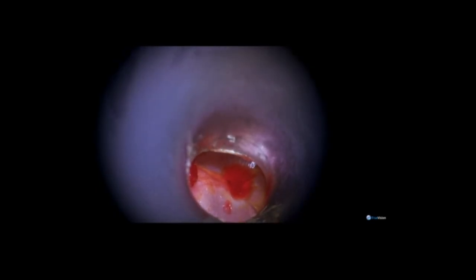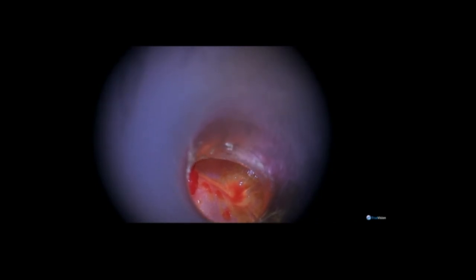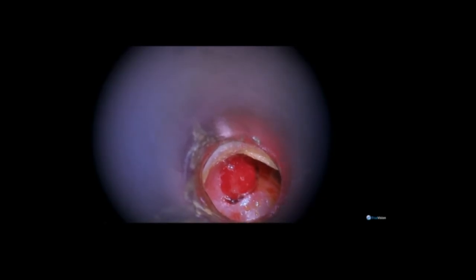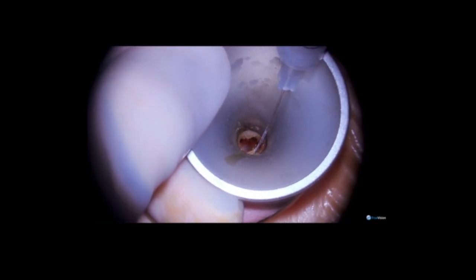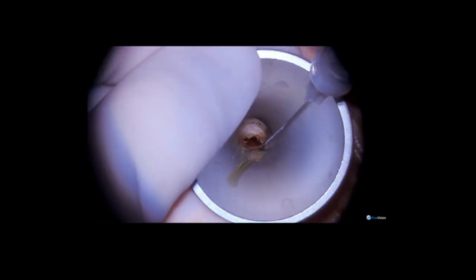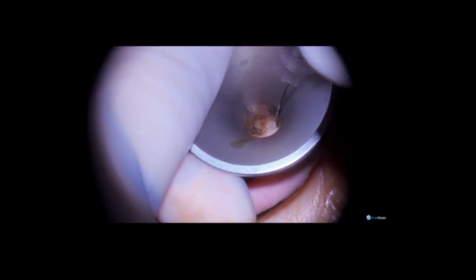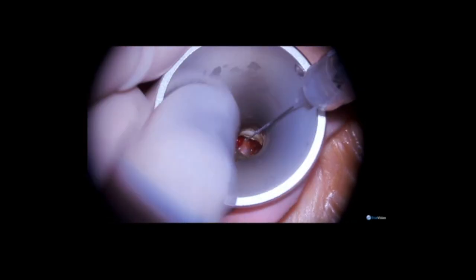Now I'm looking more inferiorly to assess the status of the remainder of the tympanic membrane. In this case, it is intact, and that is very helpful for the reconstruction. Now I am injecting a 1 in 100,000 diluted epinephrine to allow for hemostasis, and notice that I milk it down the ear canal by use of the ear speculum. We inject in multiple points around the external auditory canal to deliver the hemostatic agent.